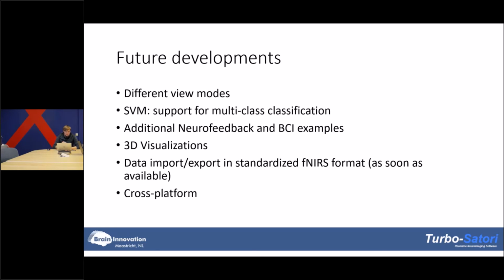Some little future outlook. So we will implement some view modes so that you don't have to just change the modes manually, but that you have really specific view modes, for example, for the topo layout, for single time courses, or for multi-channels. Then we will add multi-class classification in the SVM. We will have more examples for BCI and neurofeedback setups.